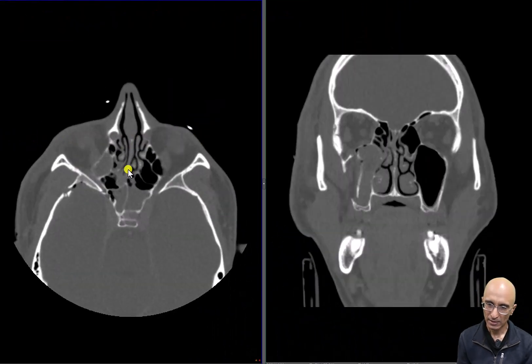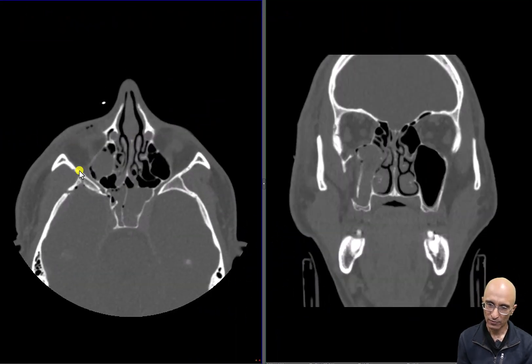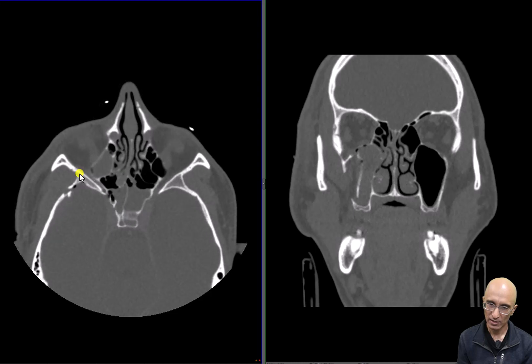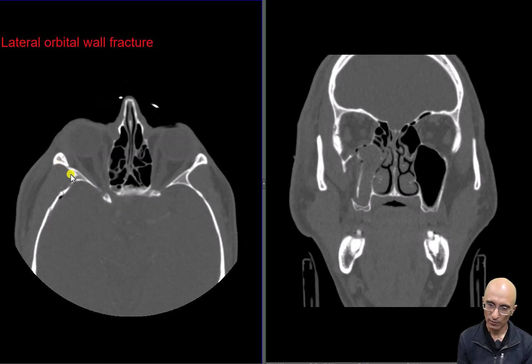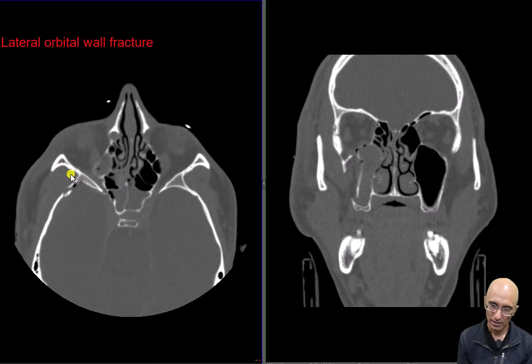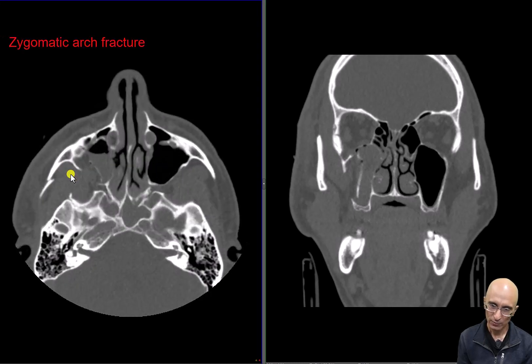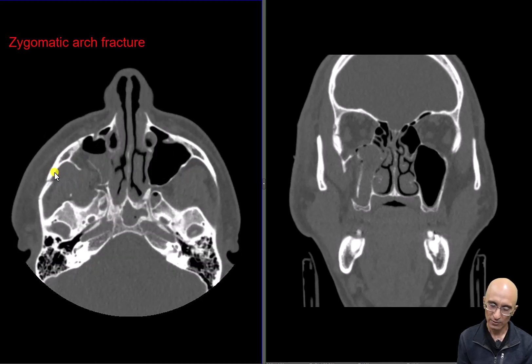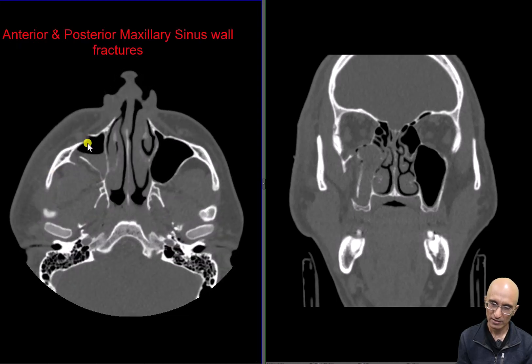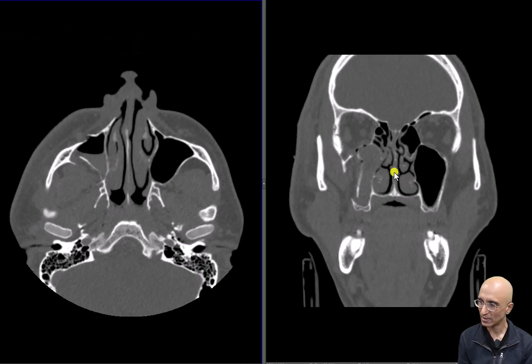On the axial images, we can see a fracture through the lateral wall of the orbit. As I scroll down further, we can also see a comminuted fracture of the zygomatic arch. There are fractures involving the anterior and posterior wall of the maxillary sinus with hemosinus.